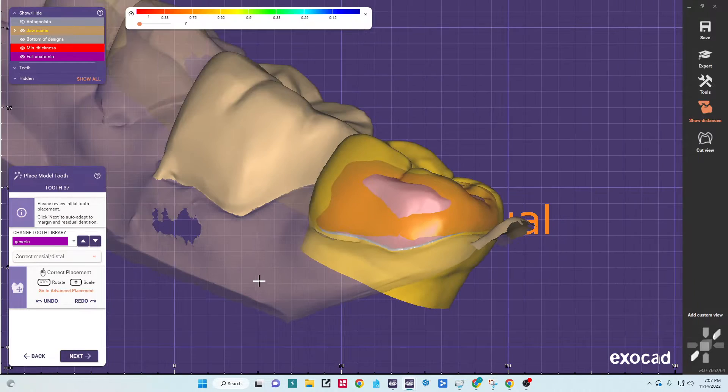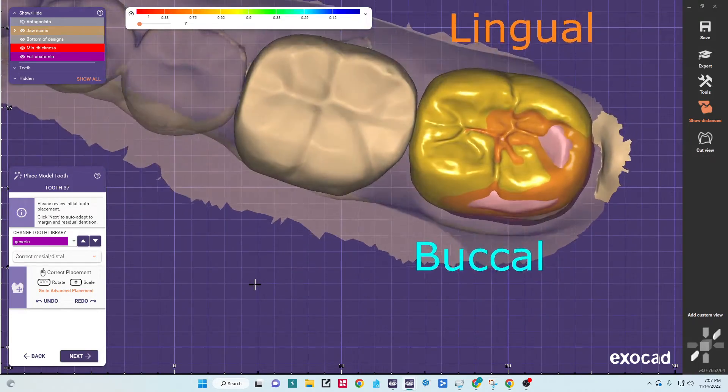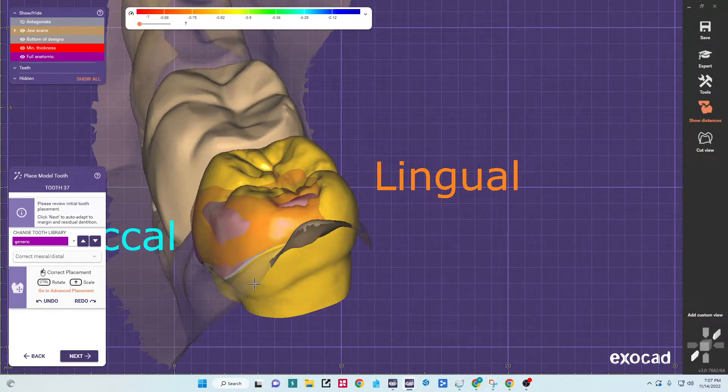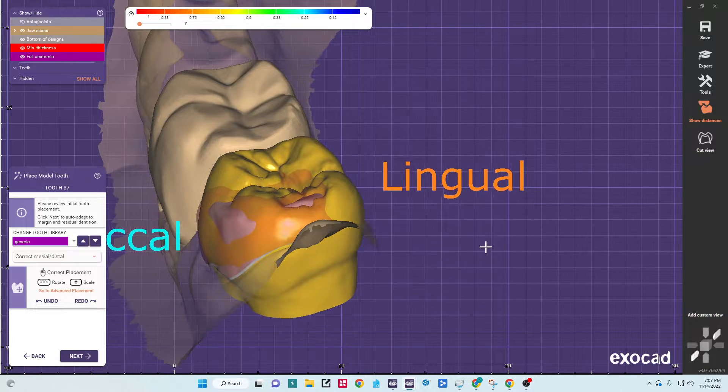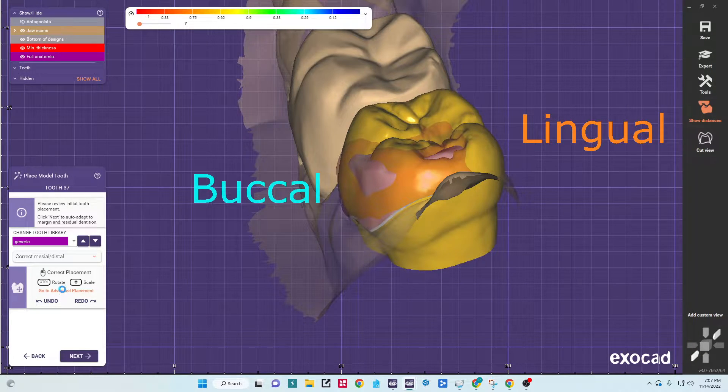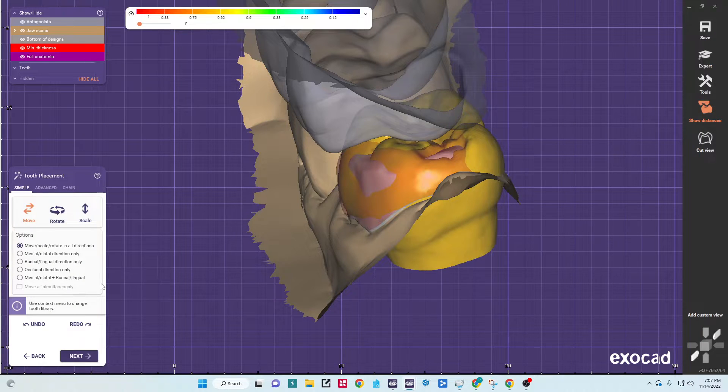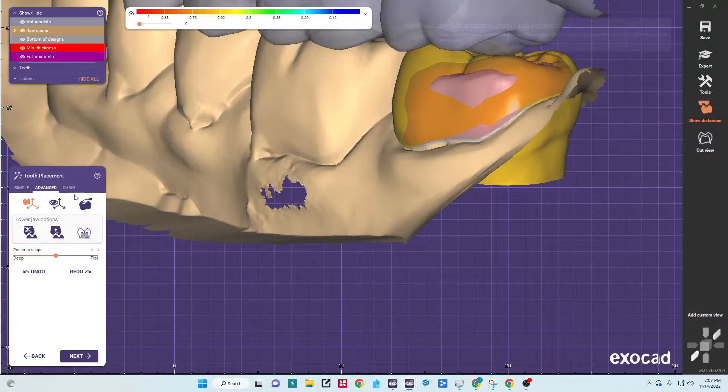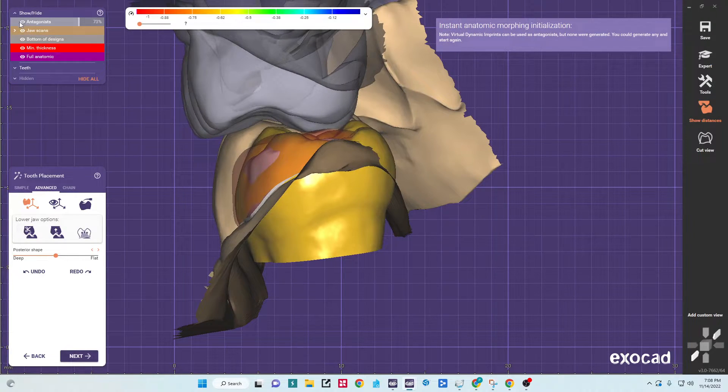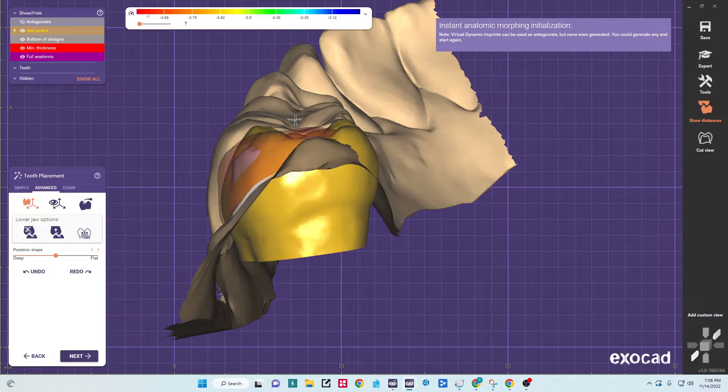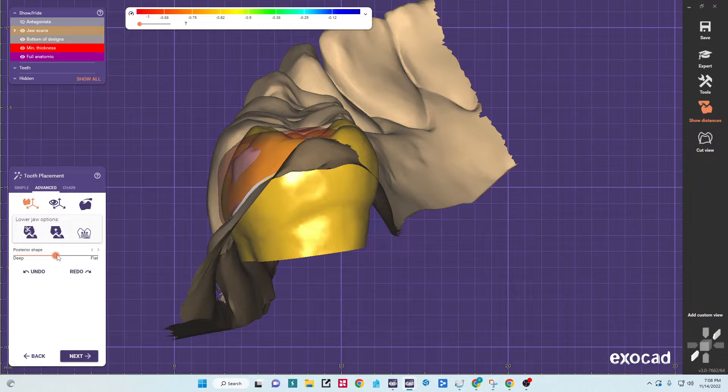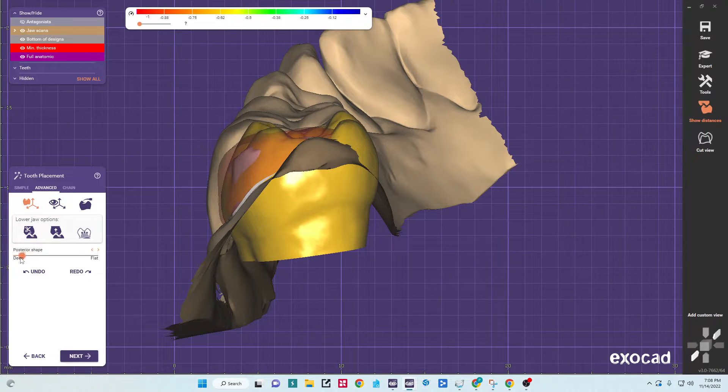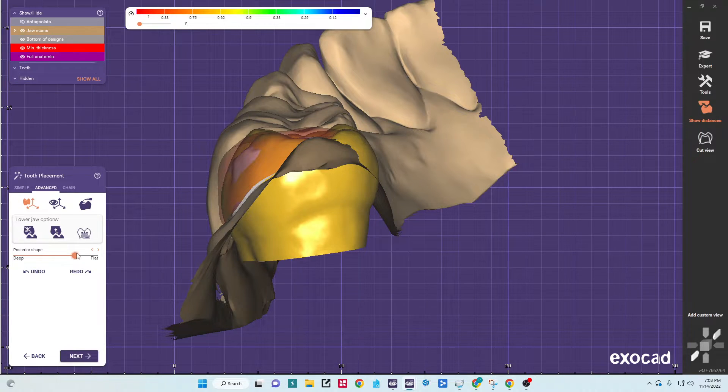The software will auto-propose a design. You can see, especially, we picked a second molar here because it shows some of the difficulty. I would go into advanced placement. I'm going to talk about a couple of the options we have here in placement. Under the advanced tab, one is I like to look down my cord. In this case, our cusps pretty well align with the neighbors. But if they didn't, we can use our posterior shape tab to modify the cusp angles. So I like to do that first.